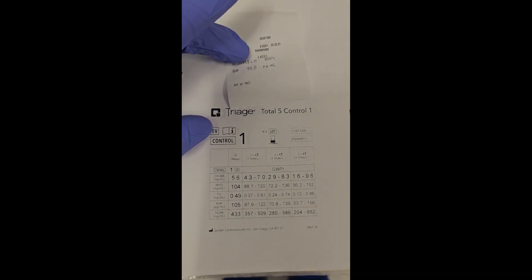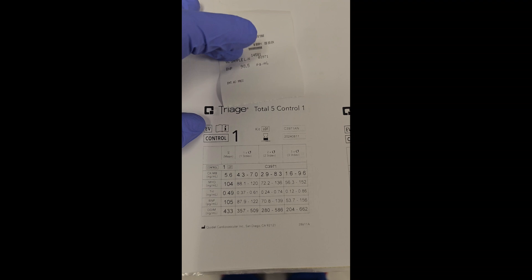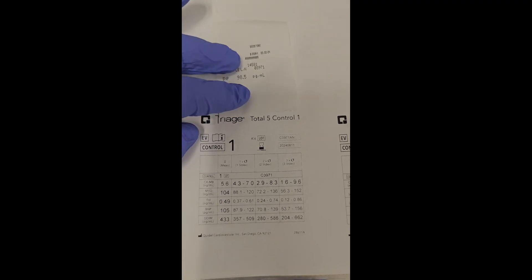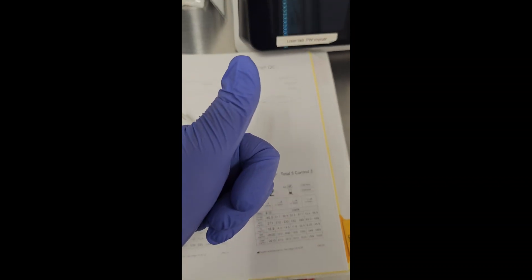BNP, two standard deviations is 70.8 to 139, so we are right in the middle. This is good to go for level one. If level two is good to go, then we are good to go.